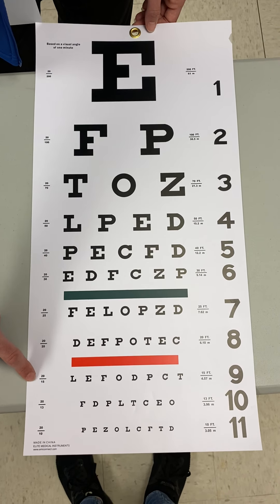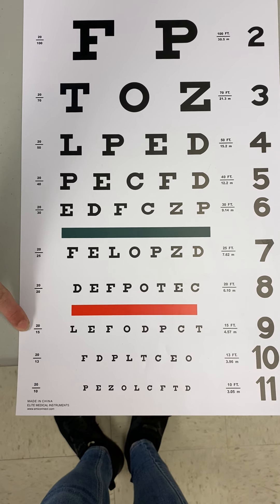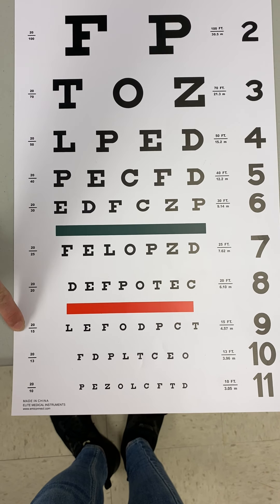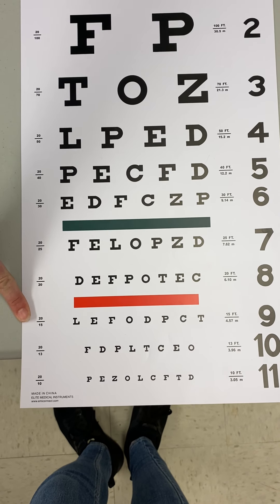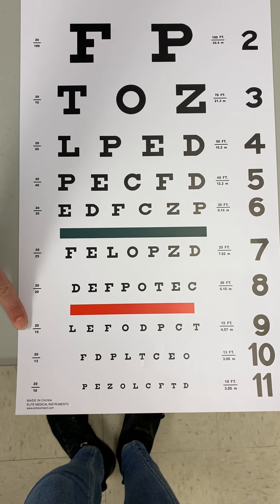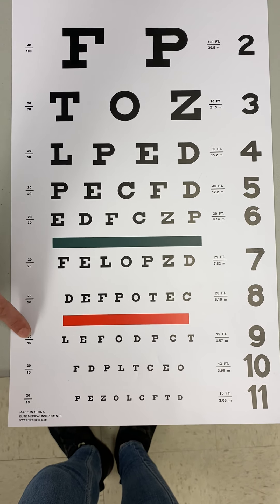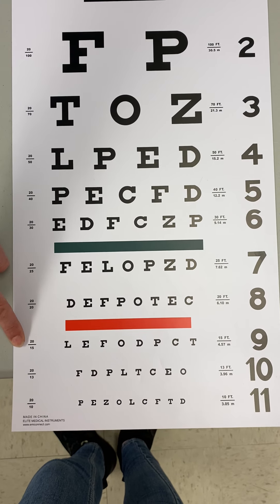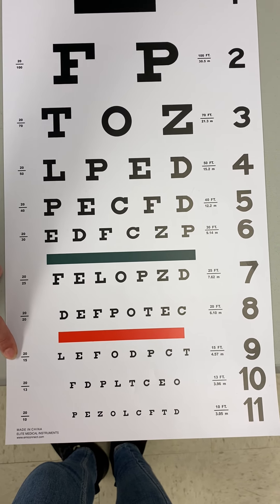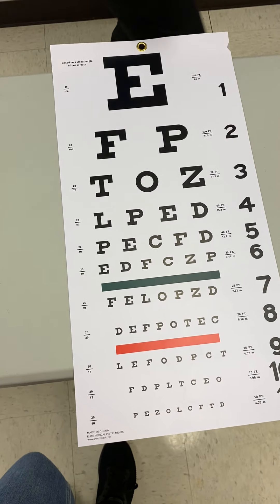Looking at line nine, it reads 20/15. With 20/15 vision, this is actually better than average. This means our patient was standing 20 feet away from the chart, but somebody with average vision would have needed to stand only 15 feet away — five feet closer — in order to read the same line. Now I'm going to grab one more chart.